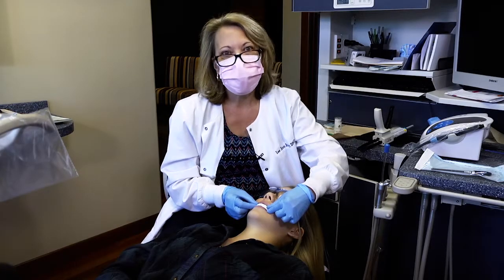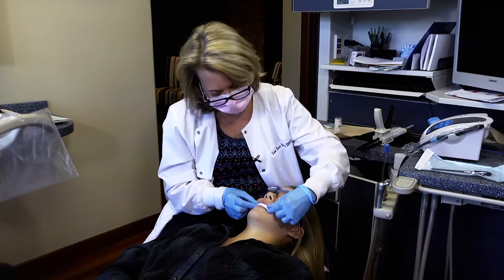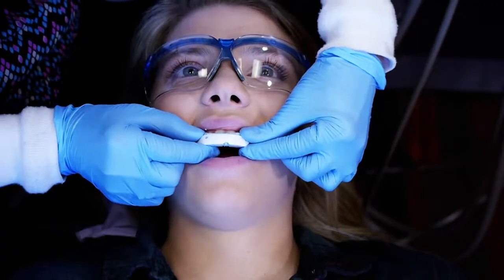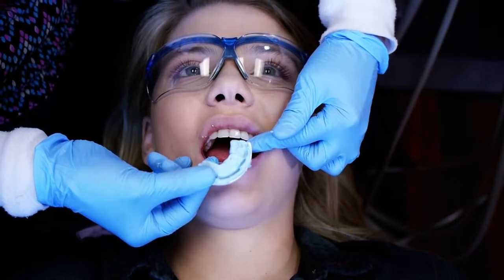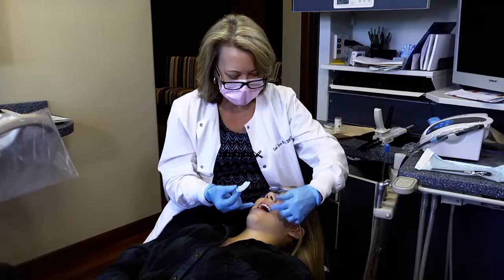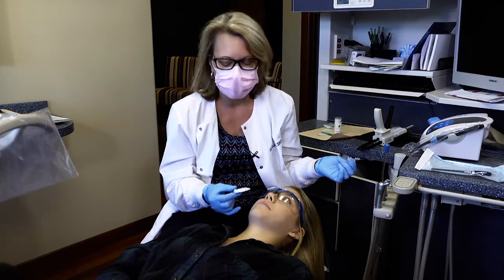So now that our bite registration material has set completely, I'm going to ask Jenna to open her teeth for me. And once she opens, I can just pop this off of her upper teeth, and I've got a relined QuickSplint. If Jenna has material between her teeth, we can go ahead and floss her teeth and we can get that out for her.